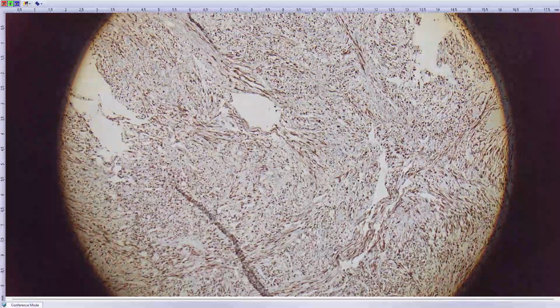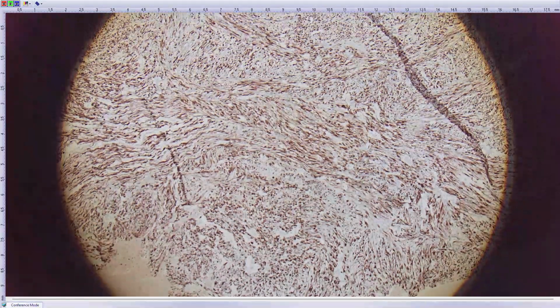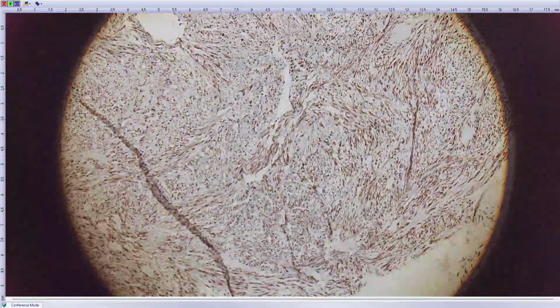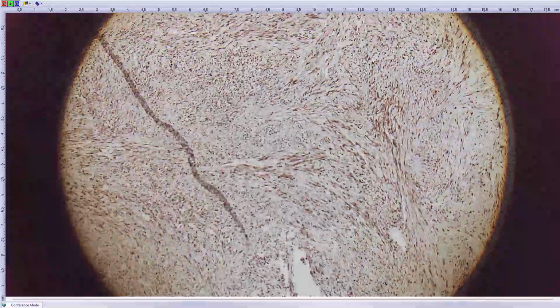So this is inflammatory myofibroblastic tumor, which is a tumor of borderline malignancy, and they quite often recur, and rarely they can also metastasize. But regarding the tumors which are limited to the uterus, as was probably this case because it was a uterine polyp, there are quite limited data. So the aggressive features are regarded as a large tumor size, more than 5 or 7 centimeters, infiltrative growth, presence of tumor necrosis, presence of atypical mitosis.